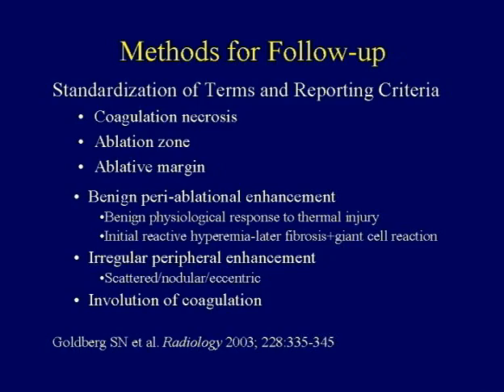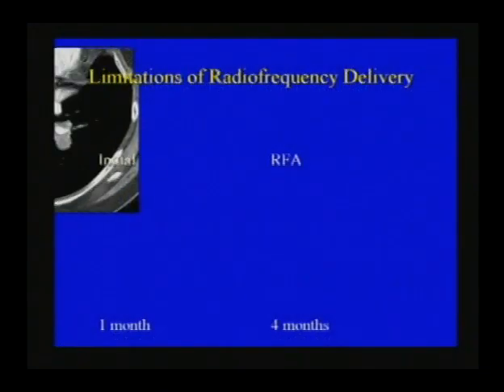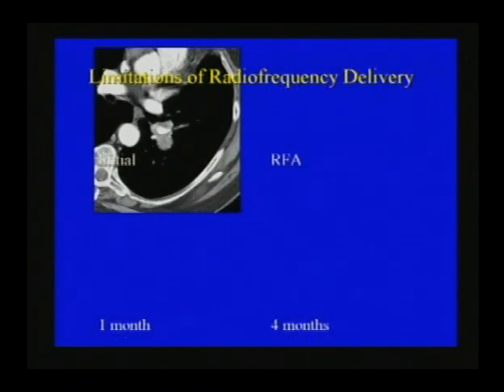The other issue that we can start looking at is, and here's another case we can quickly look at. Here's a lesion that we took on. Again, this was a case that just about met our criteria for doing. There was some discussion as to whether this was the lesion. This was a small reactive lymph node, was the hope at the time.